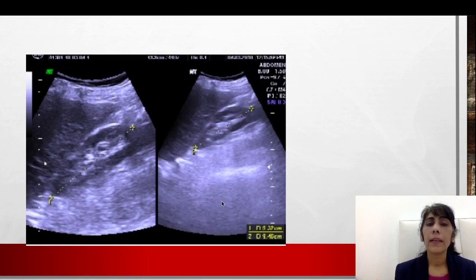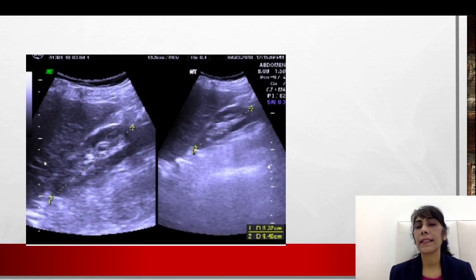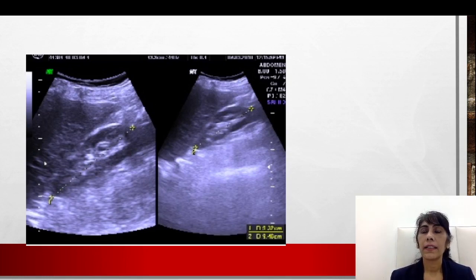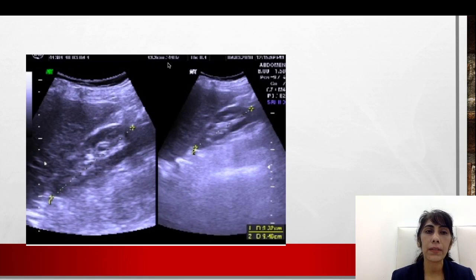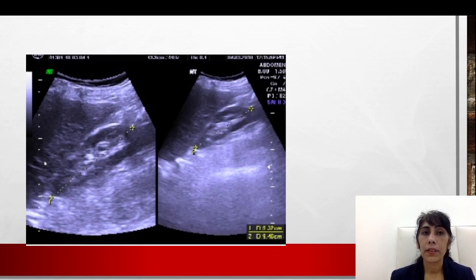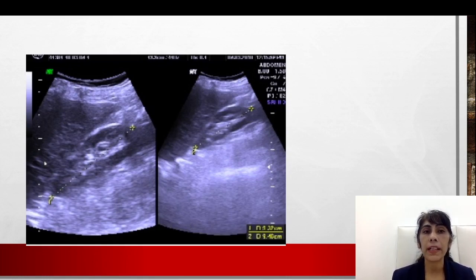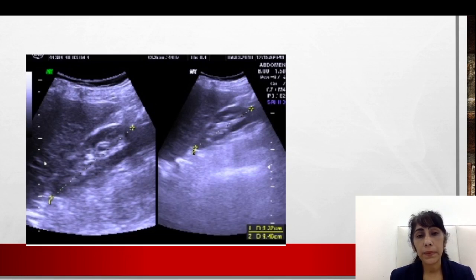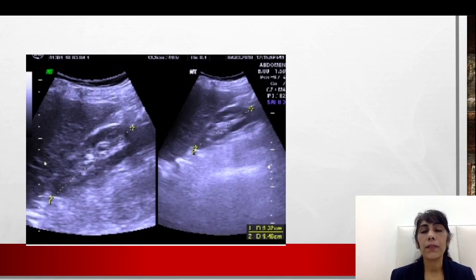Optimum depth is when you just see your area of interest and a little area beyond it. This is a better picture to evaluate the kidney. I notice that when people are learning initially, they do a TVS and the fetal node is just occupying a small area of the screen while the rest is uterus, bowel loops, and useless things. Then they ask whether pulsations are present. To see pulsations, you should focus primarily on the fetal node. When depth is kept too high, everything gets included rather than only the area of interest. Depth manipulation, gain manipulation, focusing, and orientation all become very important when doing a scan.